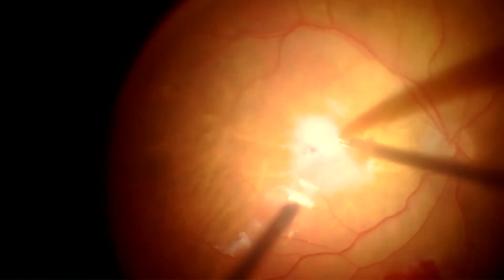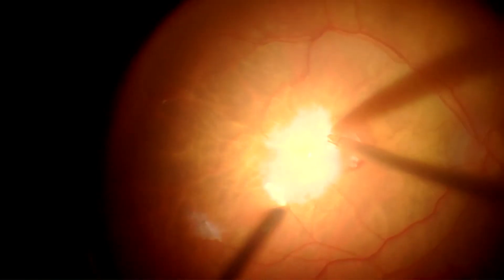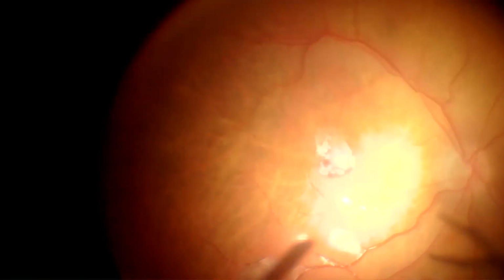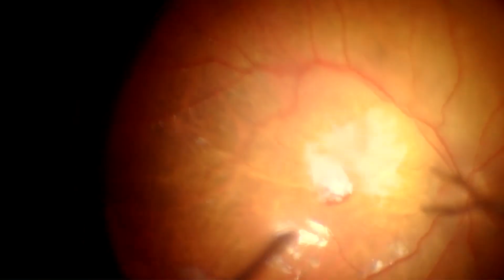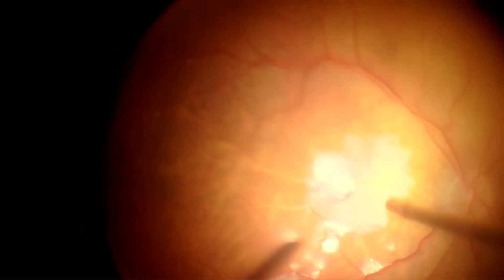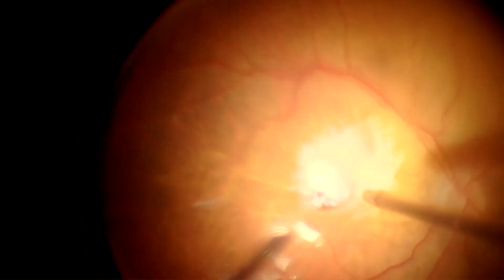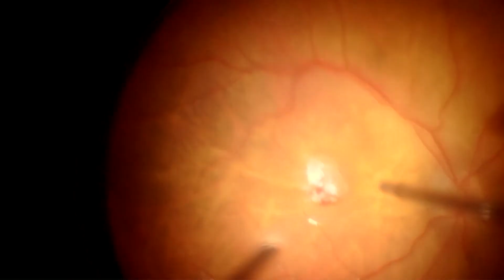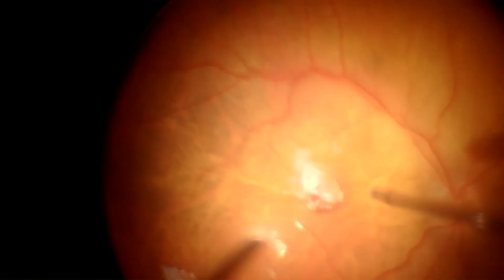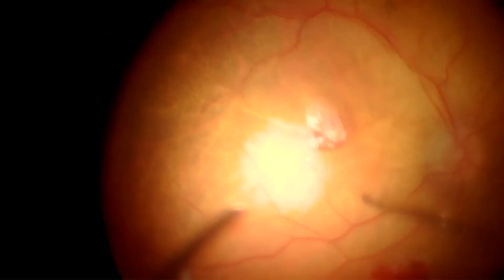And this is a perfluorocarbon liquid, this is on it, okay? So I'm trying to cover all the area. It has to be a little bit more, not much, a little bit more than the macular hole itself, because there's a bit of shrinking later on. The amniotic membrane you need to place subretinally, okay? So you need to induce a bit of detachment around. In this case, I mean, you really don't need it.